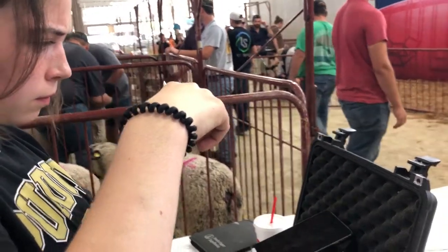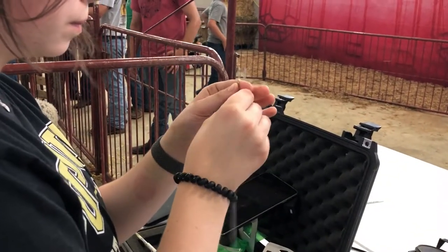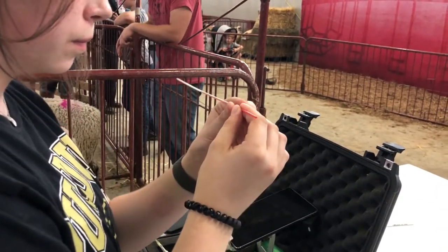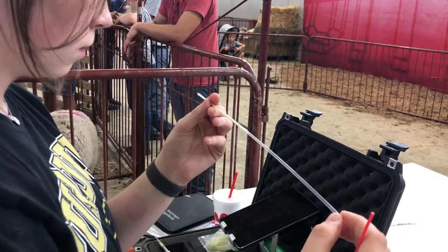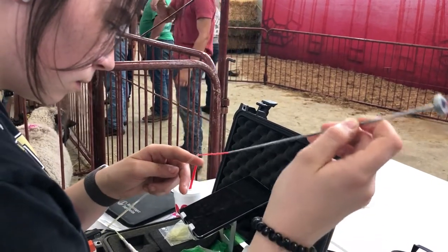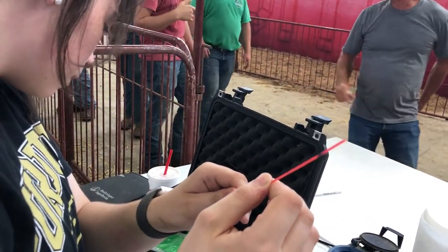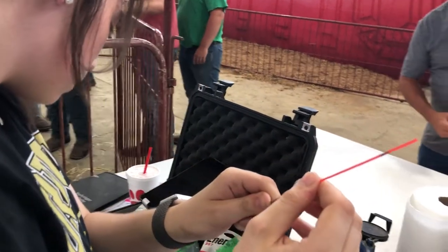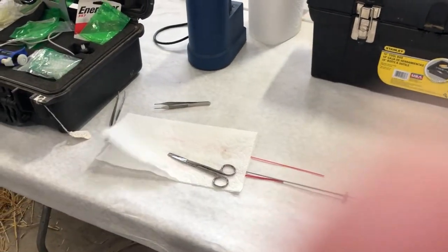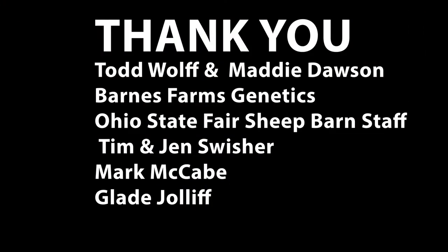Remember back at the start of the video, Todd stated how he basically injected a half of a straw of semen into each of the uterine horns. The frozen straws are pulled out of the tank and placed into a water bath where the temperature warms the sperm up slowly. The technicians then prep the syringe and attach it to the needle. Semen quality, of course, is extremely important. In 147 days, we'll know how successful we were today.